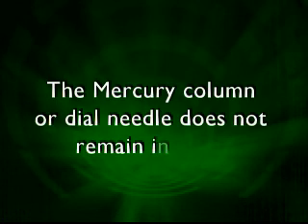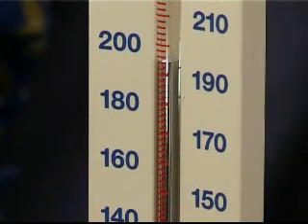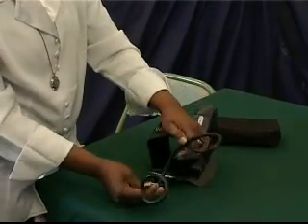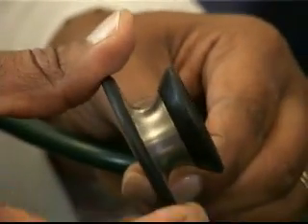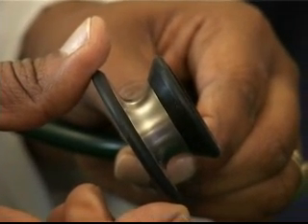If the mercury column or dial needle does not stay in place when the pressure drops on initial inflation and closing of the airflow control valve, check the cuff, tubing, and all connections for leaks. If you cannot hear auscultatory sounds, check that the stethoscope switchover mechanism is on the correct side by tapping gently on the diaphragm with your finger. If necessary, switch over. Check that the stethoscope diaphragm is not damaged.